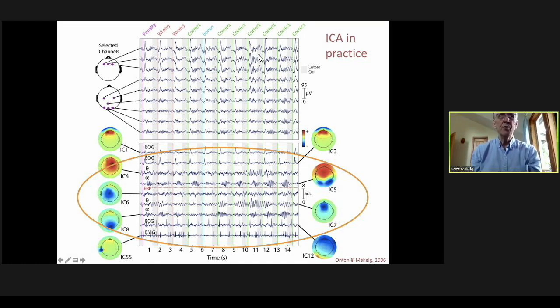And we see what we mean by temporal independence. You don't see any of this in this. You don't see any of this in this. You don't see any of this in this. And these are all separated simply by spatial filters. Spatial filters that cancel out activity from the sources of all these places and leaving activity from one place.